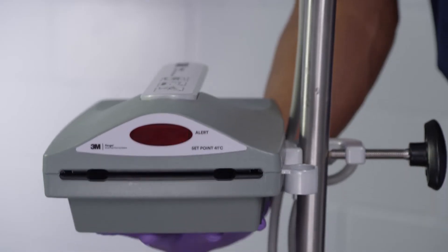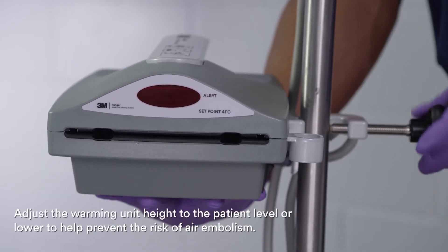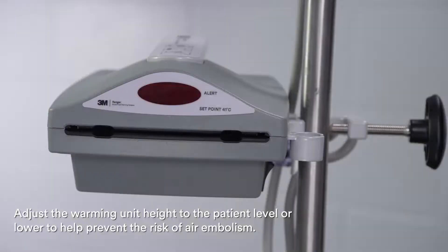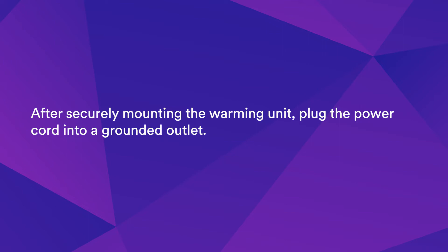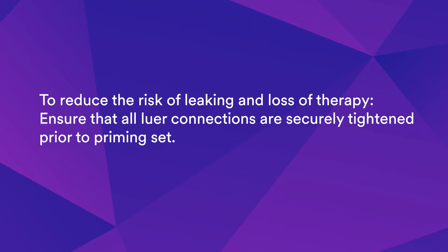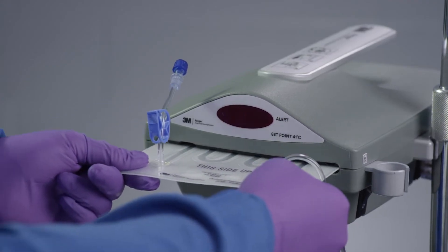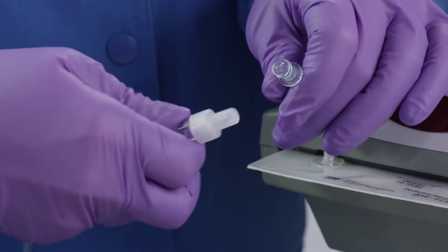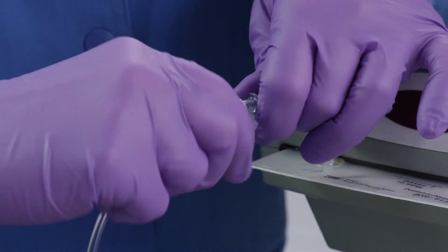To begin use of the blood fluid warming unit, adjust the warming unit height to the patient level or lower to help prevent the risk of air embolism. After securely mounting the warming unit, plug the power cord into a grounded outlet. Open the warming set pouch where indicated by the arrows. To reduce the risk of leaking and loss of therapy, ensure that all luer connections are securely tightened prior to priming. Before priming, slide the fluid warming cassette into the slot in the warming unit. Connect the inlet line on the Blood Fluid Warming Pediatric Set to the fluid source.